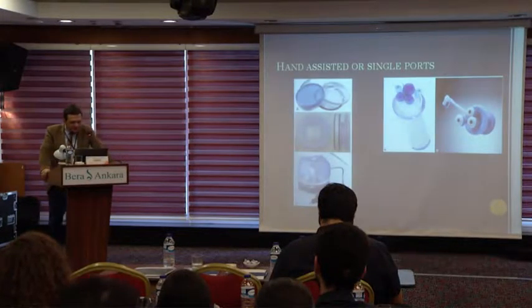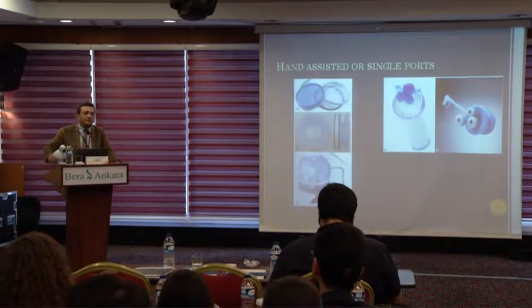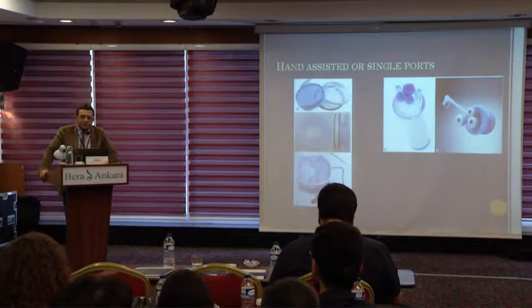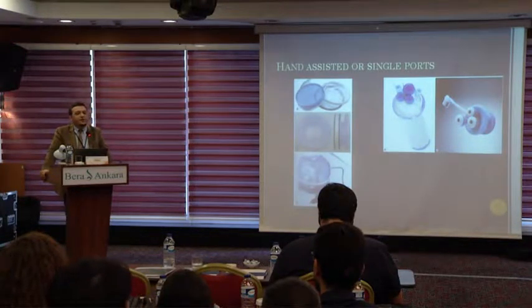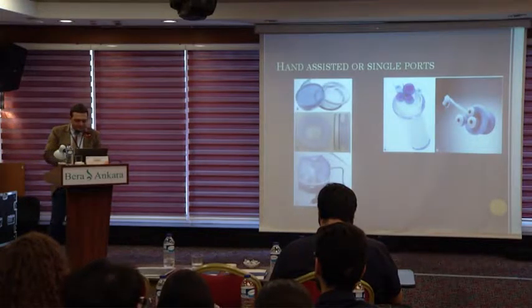Hand-assisted laparoscopy is another type of minimally invasive surgery, especially at the beginning of the learning curve. It's very useful and it makes you feel safe. With experience, for better cosmetic results, you can level up and use single site or single port surgery. For this type of minimally invasive surgery, you have to use special trocars like this.